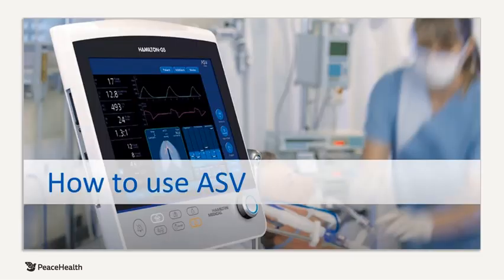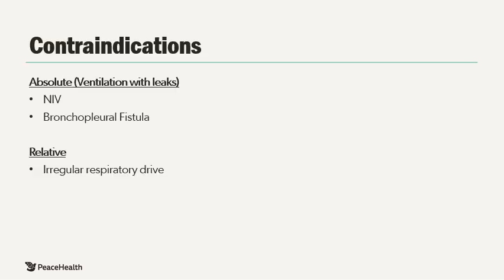Now we've truly become ventilation geeks, haven't we? And we've explained how complex and sophisticated ASV really is. But right now, let's take a step back and realize how simple ASV is to use for the caregiver.